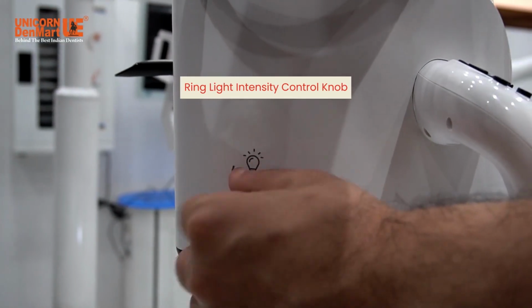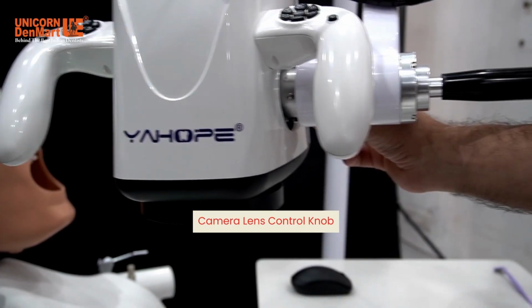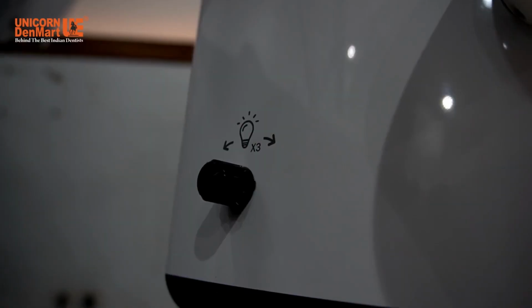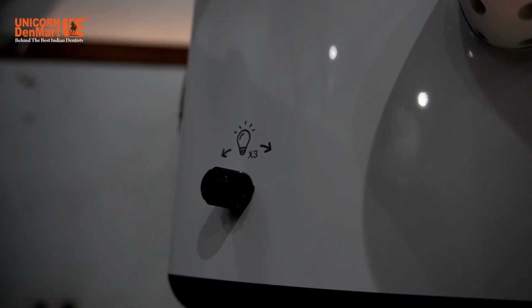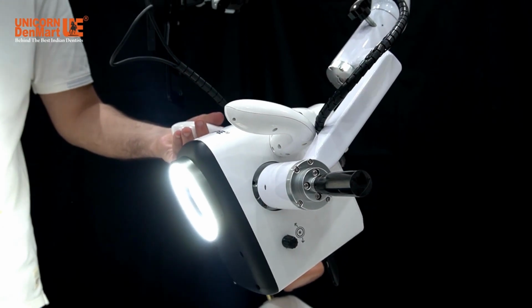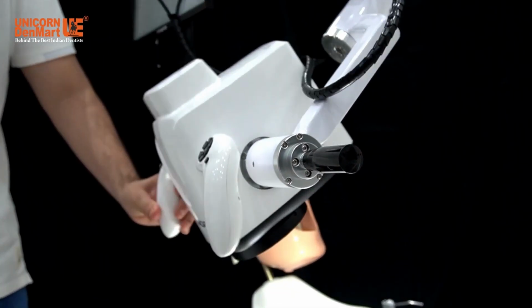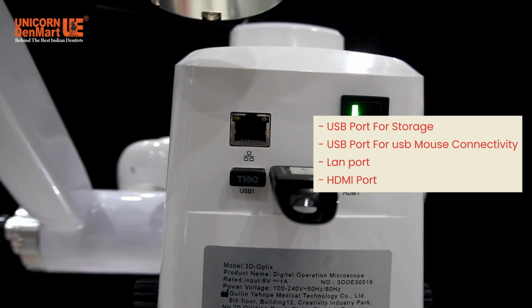For example, here I have reduced the intensity, and here inside my microscope will be the camera lens light. I can increase or decrease that too. These knobs are very easy to operate and very easy to handle. Even at the time of surgery, it's hardly going to take you a second or two. Then backwards and forwards, I can move it almost 90 degrees both ways, right?